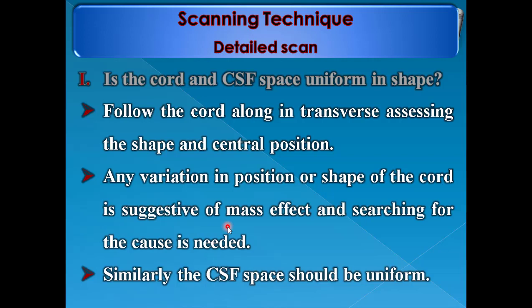Then we come to the detailed scan. Our aim is to answer six questions. The first is: are the cord and CSF space uniform in shape? Follow the cord along in the transverse plane assessing the shape and central position. Any variation in position or shape of the cord is suggestive of mass effect, and searching for the cause is needed.